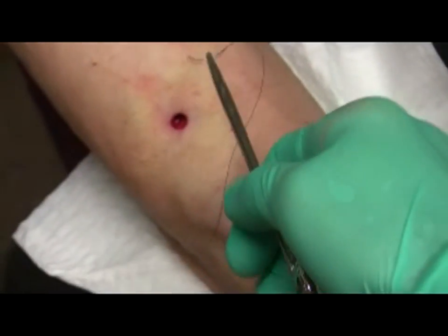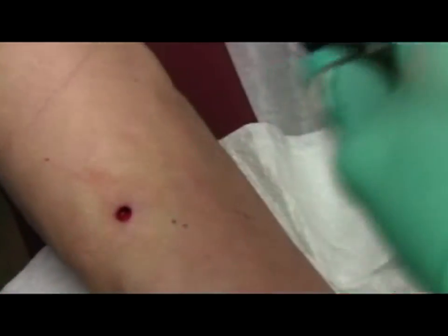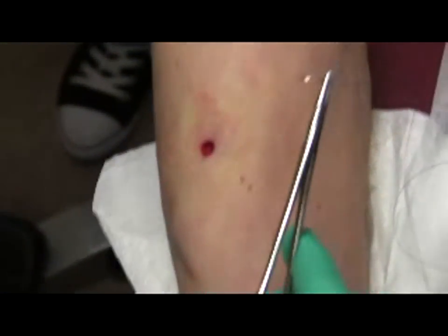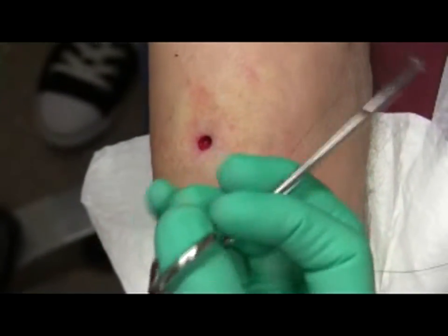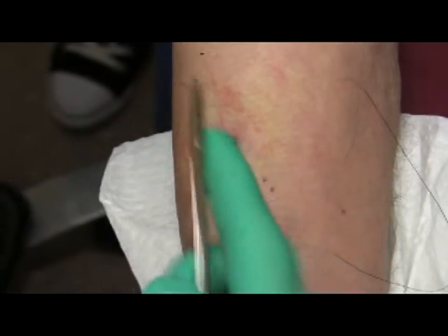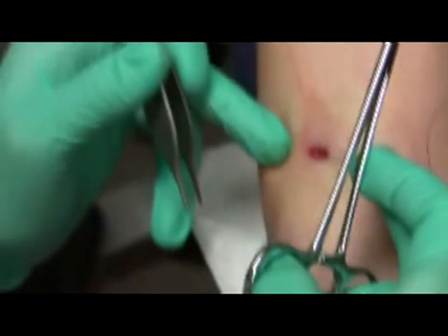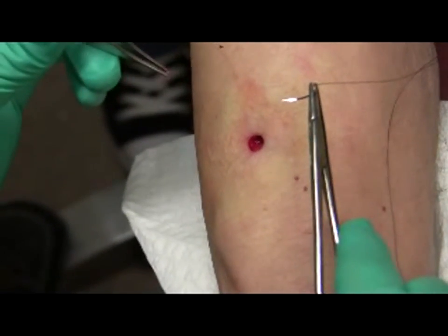You don't have to negotiate going from here to getting your fingers back in the hole and then grabbing it. So it's much better to just have your fingers in the hole all the time. Those who disagree say you should hold the loops in your palm, placing your index finger on the suture holder near the needle, pointing parallel to the tangent of the needle's midpoint convexity — pushing the needle through with the index finger rather than twisting through using the wrist. The advantage of fingers in the loops is that you needn't constantly put fingers in and out of the loop every time you grab and release the needle.